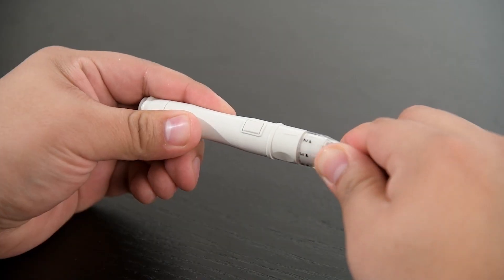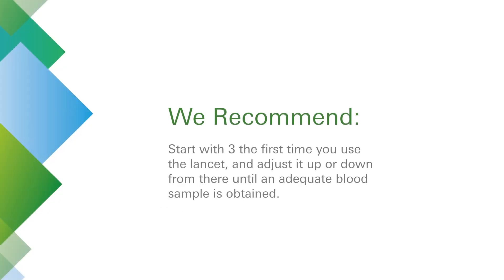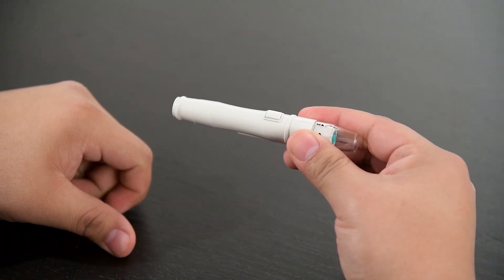Select the puncture depth of the lancet. We recommend starting with 3 the first time you use the lancet and adjusting it up or down from there until an adequate blood sample is obtained. Now pull back on the charger — a click may be heard.